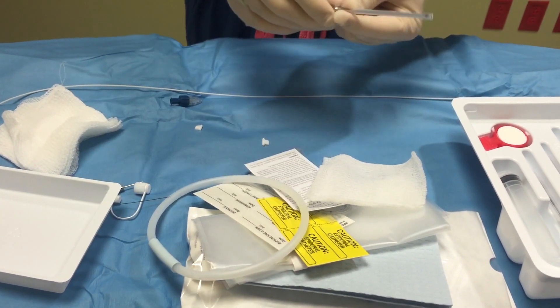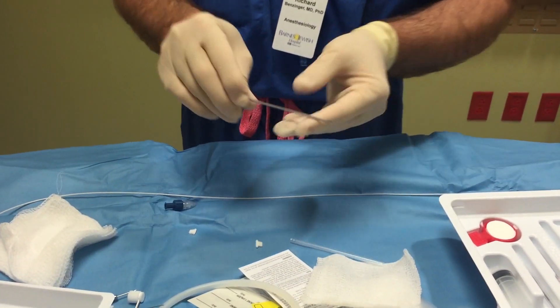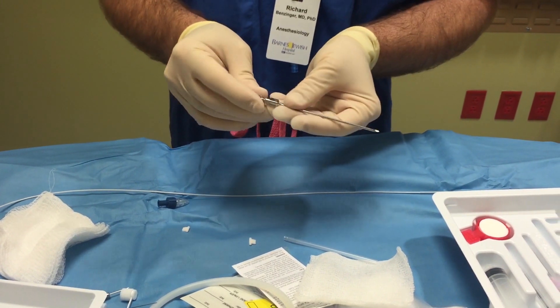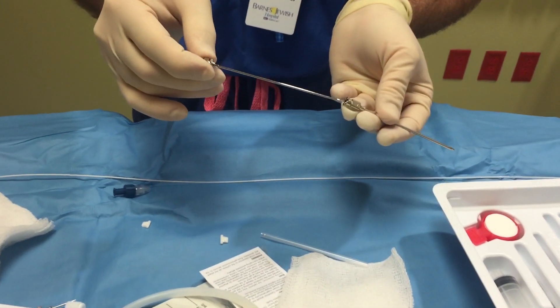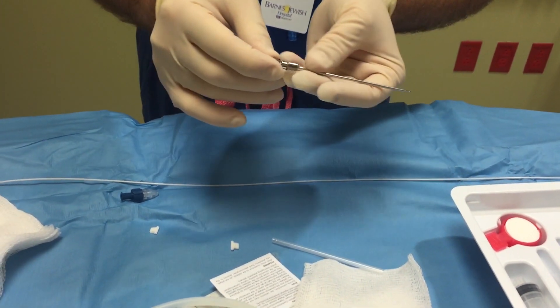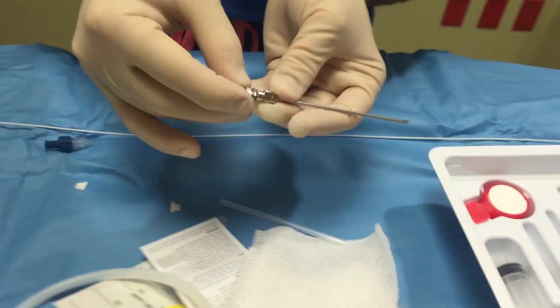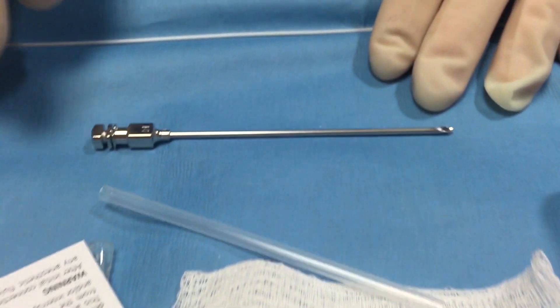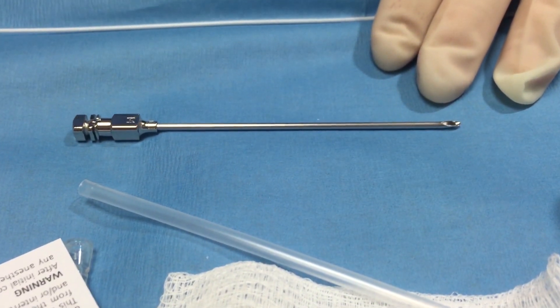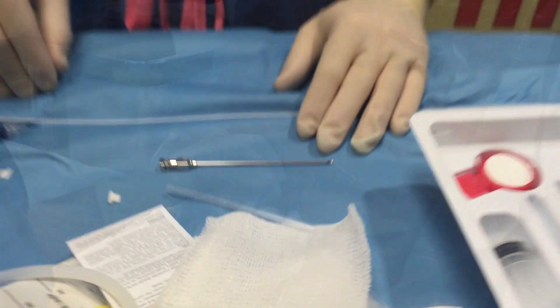The needle itself resembles an epidural needle. It has an inner trocar, and it has a notch that aligns to tell you that the trocar is placed properly.